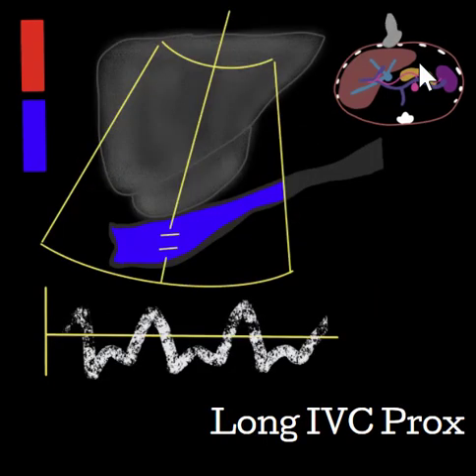Turn the probe into a sagittal position. Using the anterior abdominal window, elongate the IVC. The IVC should be mostly blue with flashes of red due to pulsatility. Using pulsed wave Doppler, the waveform will also appear pulsatile, with a W appearance in the waveform that should be below the baseline. Evaluate for patency and flow direction.